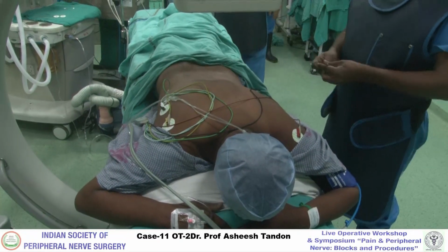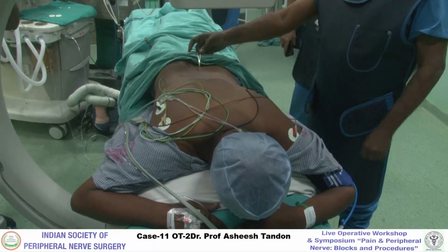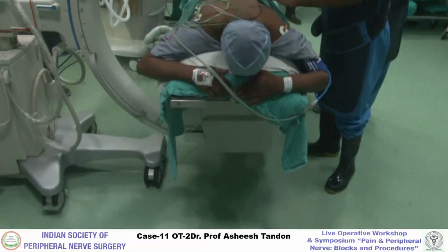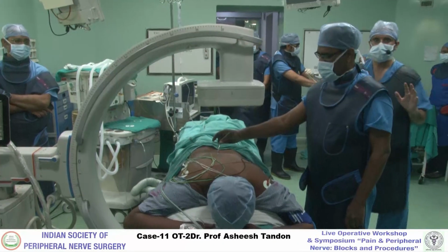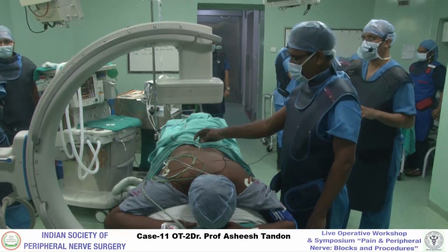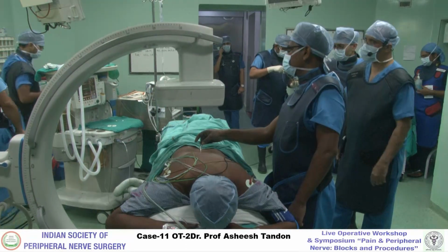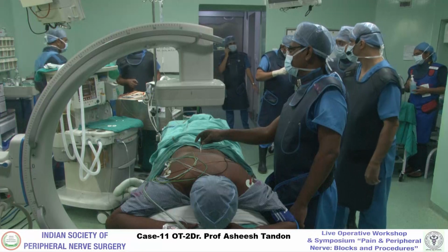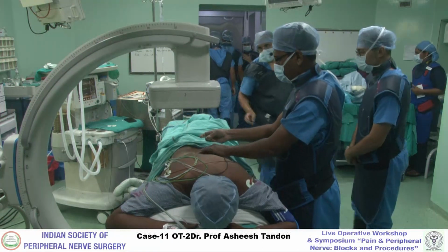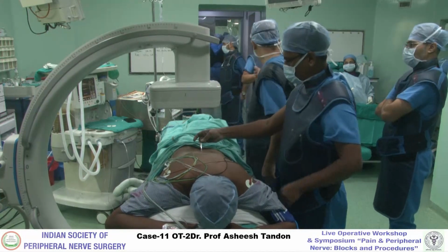And, okay. And then, ideally, even if we do an interlaminar epidural in this case and observe, that should be more than enough. But in the interest, we are doing not just an interlaminar epidural, but also a far lateral. Okay. So we are marking. Marker pen, please.